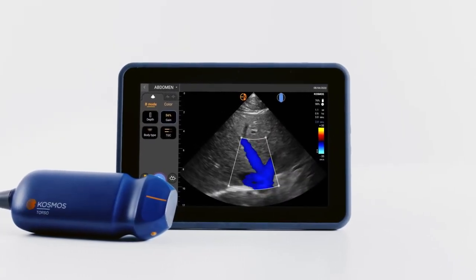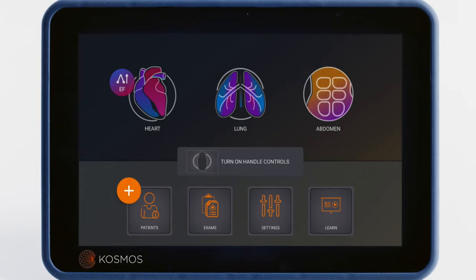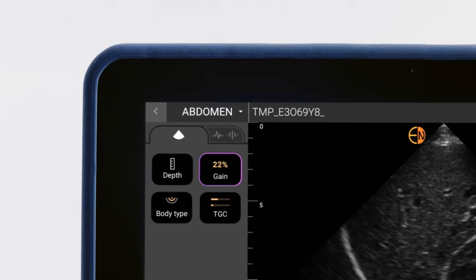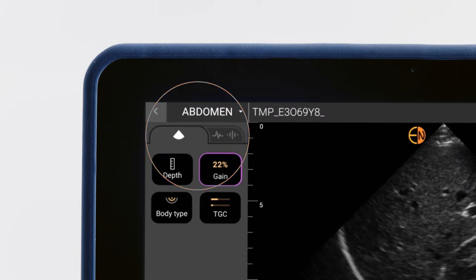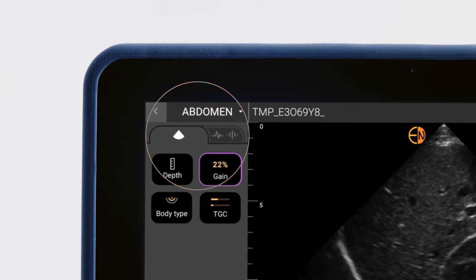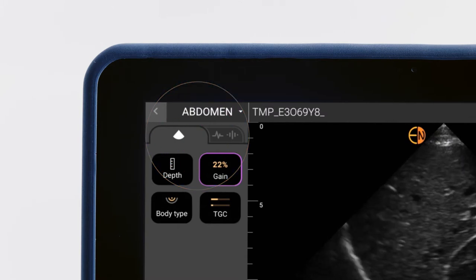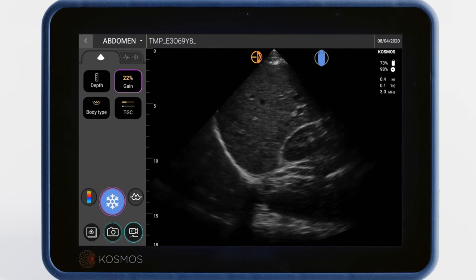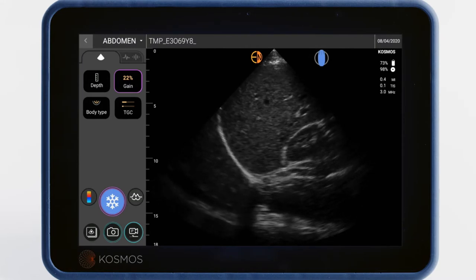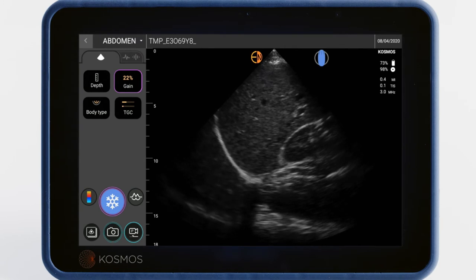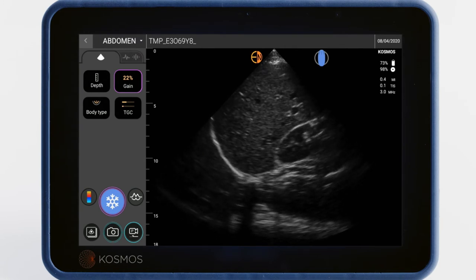Let's start scanning. We'll be scanning the abdomen in this tutorial, so we'll tap the abdomen icon. On the left, you'll notice two tabs: one for ultrasound and one for ECG and digital auscultation. In video 4, we'll show you how to scan while simultaneously capturing those signals. In this video, we'll focus on the ultrasound tab.